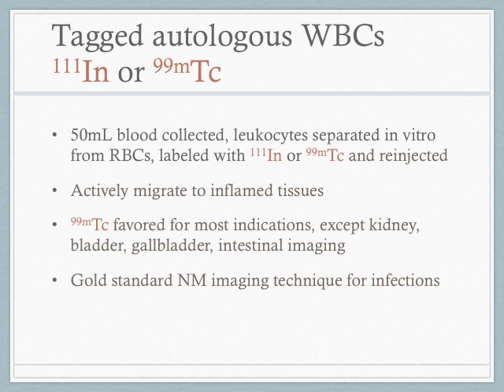They've done studies where they think it's pretty accurate. The radioisotopes don't impede the migration of the white blood cells at all. Technetium today is favored for most indications, except for if you're worried about the kidney, bladder, gallbladder, or intestinal imaging, because it can accumulate in those areas.